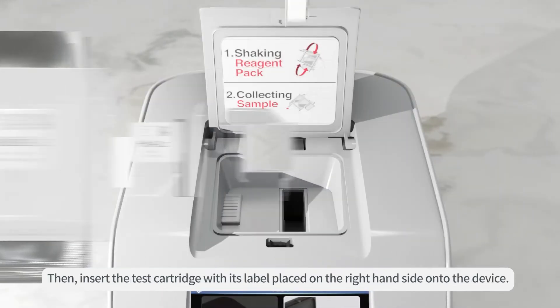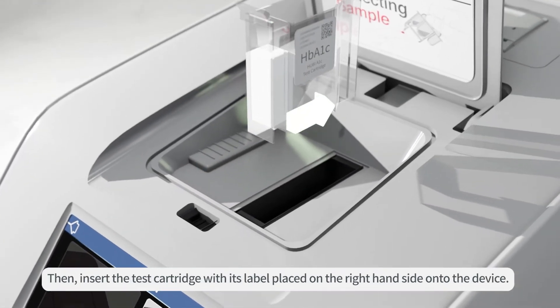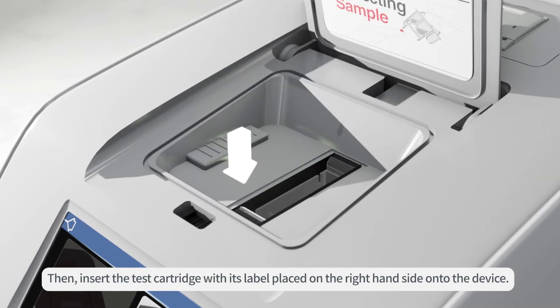Then, insert the test cartridge with its label placed on the right-hand side onto the device.